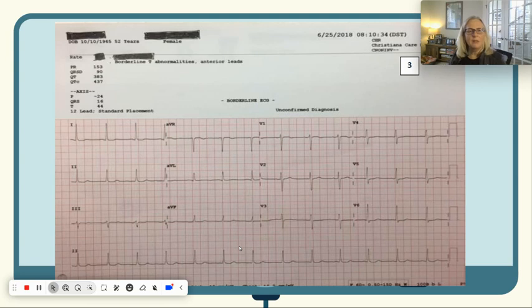So when you think you have it, go to its opposite and see if the opposite of that is the smallest. Confirm your findings and see if that is the smallest QRS. Okay, once you confirm that that's the tallest, write down the number on the wheel, the degrees, the angle at which it sits.